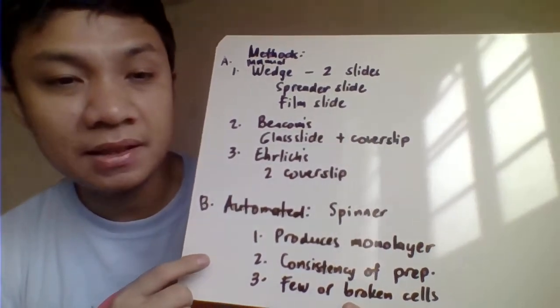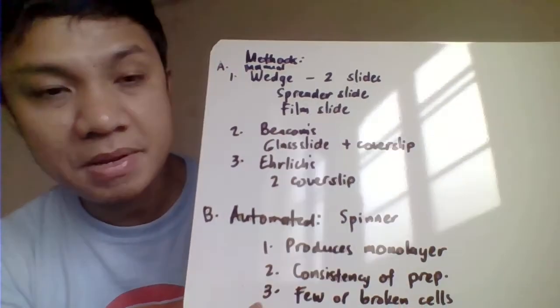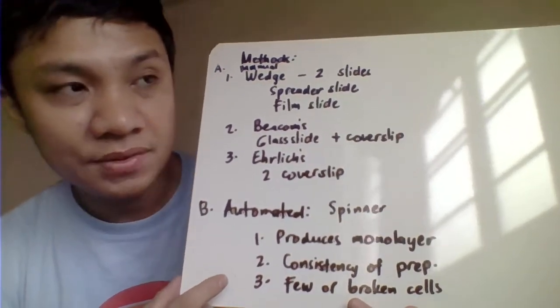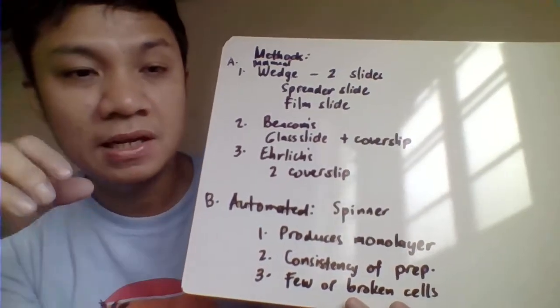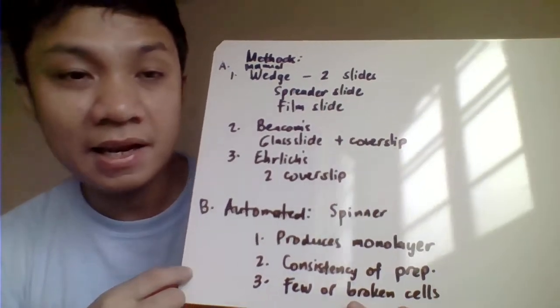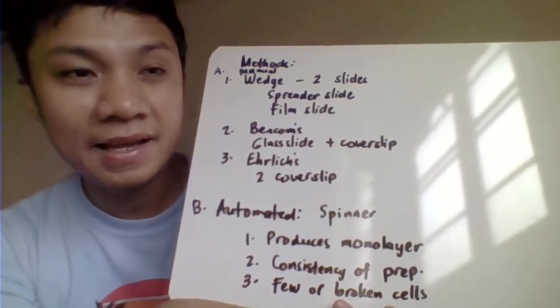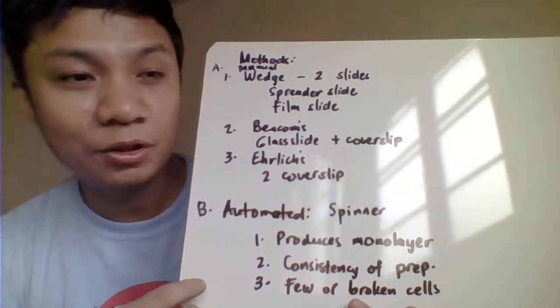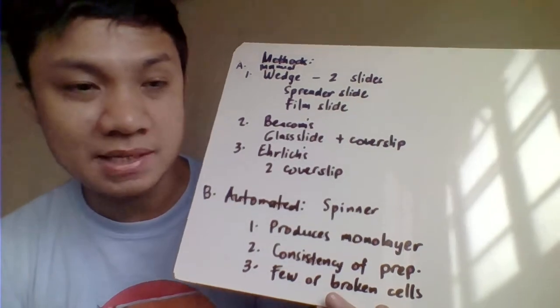Automated instrument here for your blood film preparation. Example for that, we have the spinner instrument. Since it is automated, it would have a homogeneous blood film preparation. So, it's consistent. It's not trial and error, unlike with us, right? So, okay, we always just try to make a perfect film. With it, it's almost always perfect.